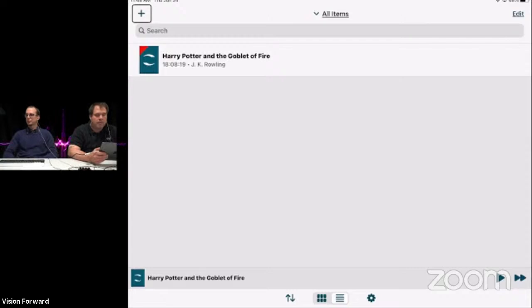When I've opened up my app here, I'm brought right to my library. My library is going to show me any materials I've already imported into VoiceStream Reader. I just have one right now, but as you import more and more, you can create folders to better organize as well. But first, before we dive into looking, let's add a piece of content. We're going to add something directly from Bookshare here.